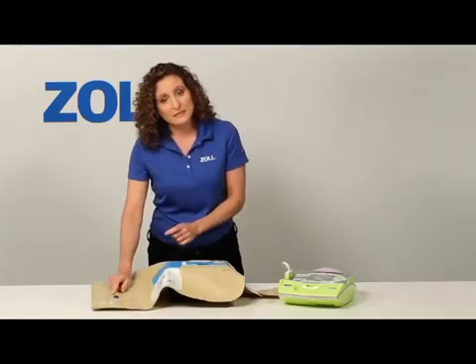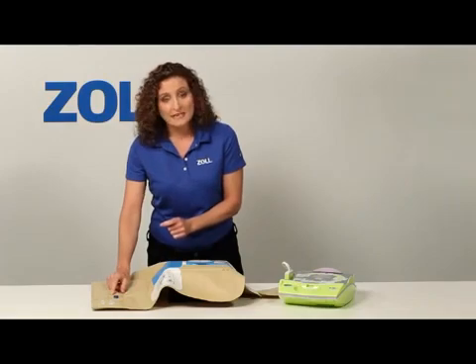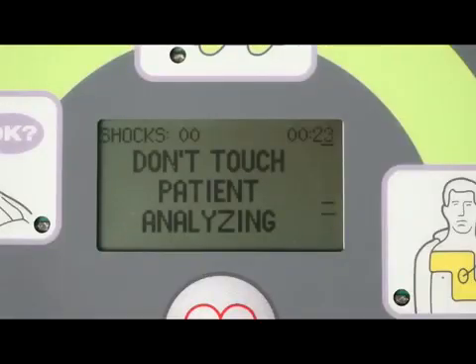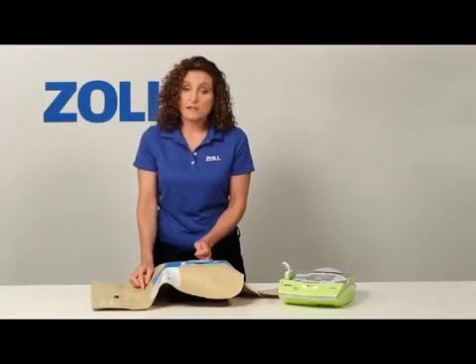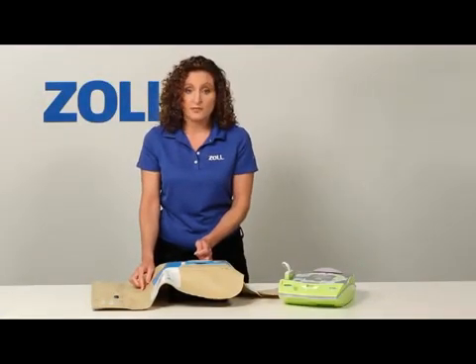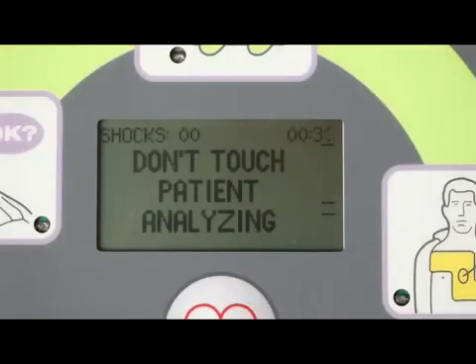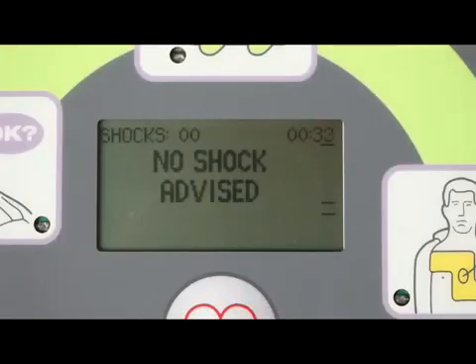Here, I would apply the pads. I will set the simulator to present asystole, an unshockable rhythm. Don't touch patient. Analyzing. The AED Plus recognizes the presence of a heart rhythm and begins analyzing it. Don't touch patient. Analyzing. No shock advised.